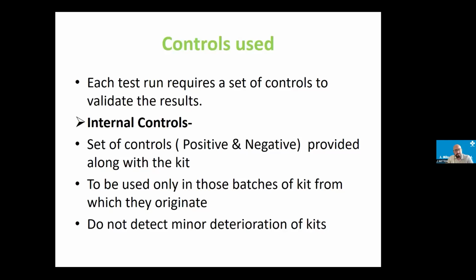NAT test is not mandatory as per the Drugs and Cosmetics Act. You can add NAT to your protocol, but it is not a mandatory test. But CLIA is a mandatory test. So either CLIA or ELISA, you have to run one screening test. If it is CLIA positive, according to the Drug Act, we have to discard it.